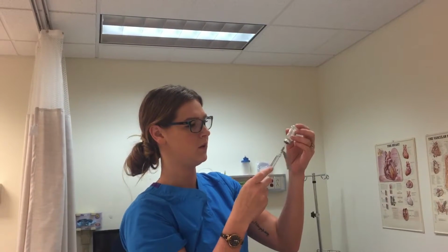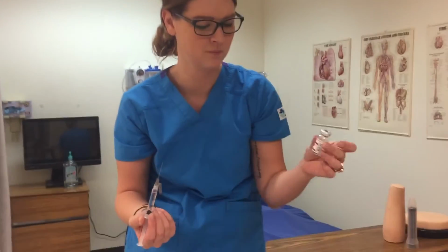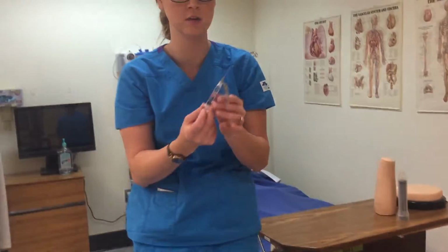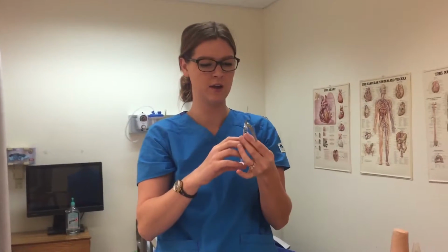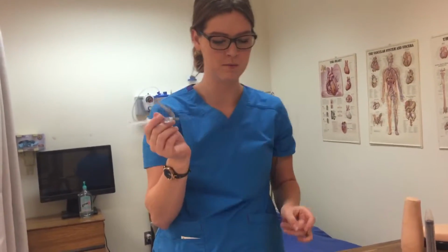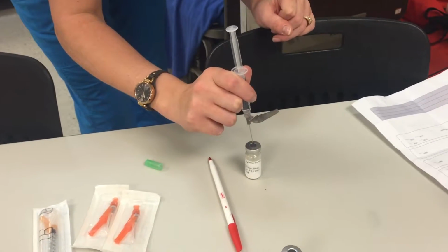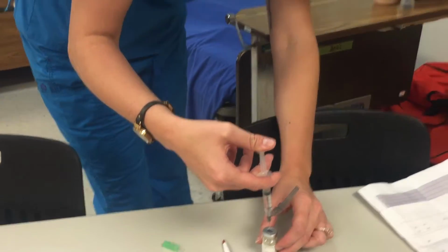Okay. So right now I have 3 mils of liquid. And I would do whatever my company policy or procedure is for this, if it's to save it or toss it. Get the air bubbles out. I don't really have to prime it, but I'm gonna get all that air out of here. Okay, now I'm gonna inject my 3 mils into the powder, which I've cleaned the top of the powder, so that's okay. Inject it.